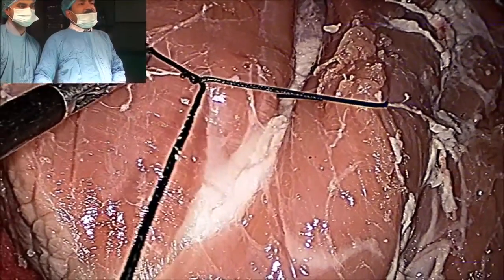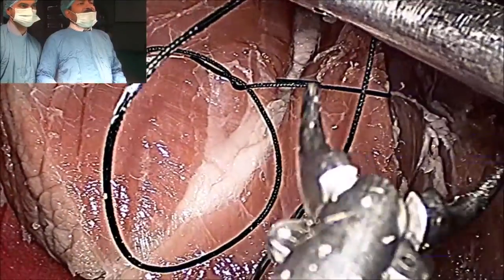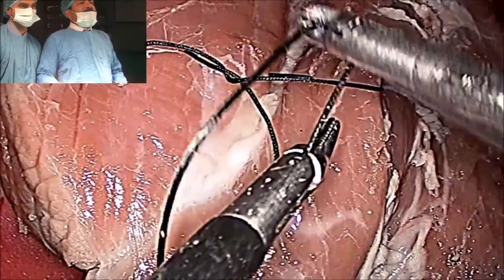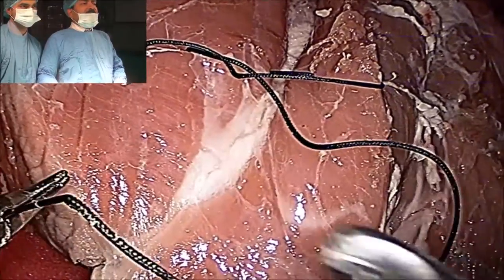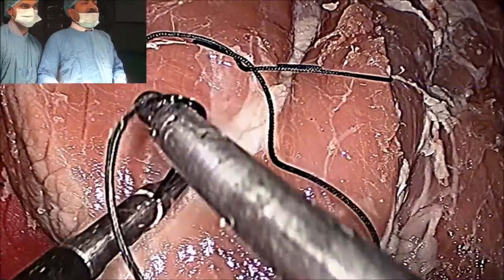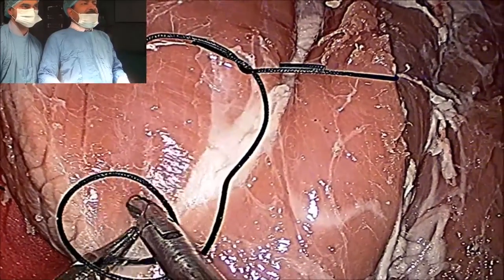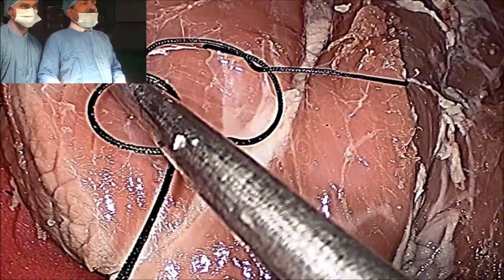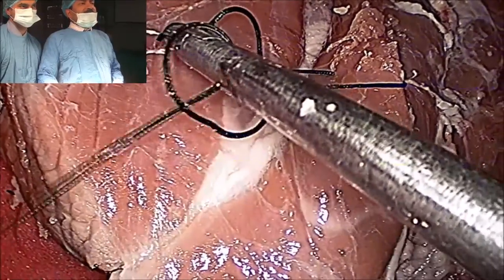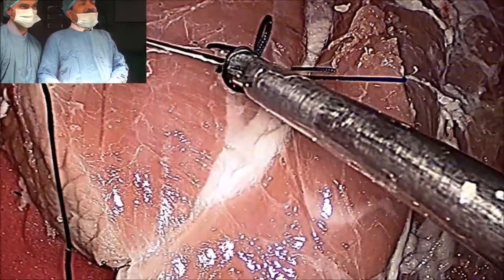The tail should be loose and the long end should be straight. Then you will make a reverse C shape. This is the reverse C, and this is another half of the knot. After that you will just hold the tail but don't pull it — keep it loose. Then the left hand instrument will slide, and here this is the knot.